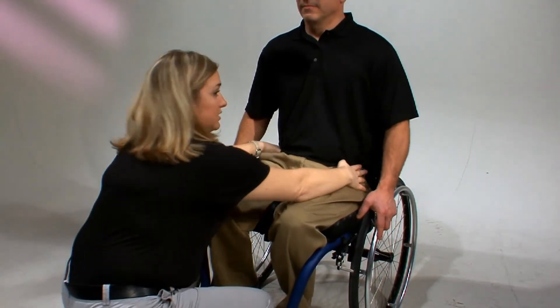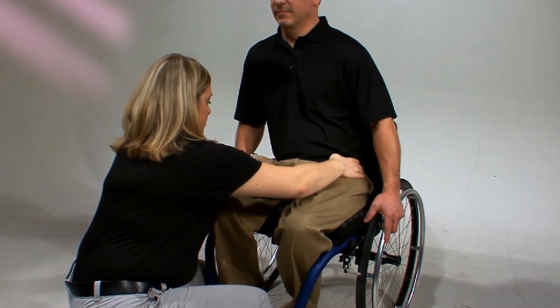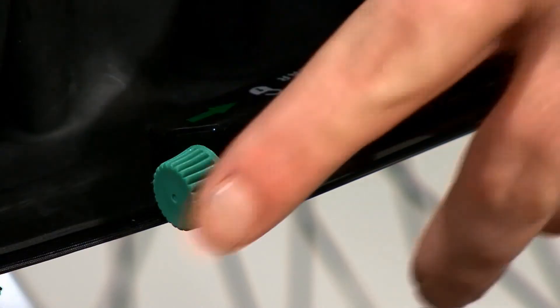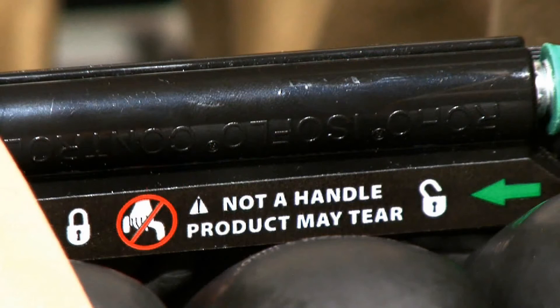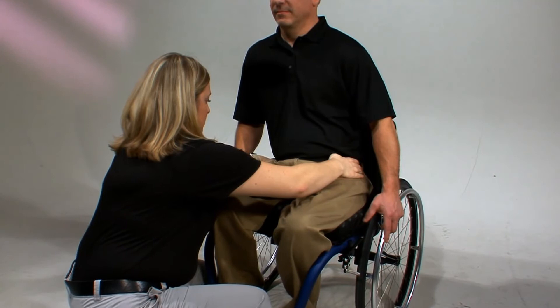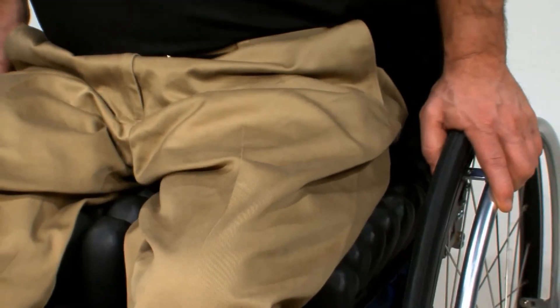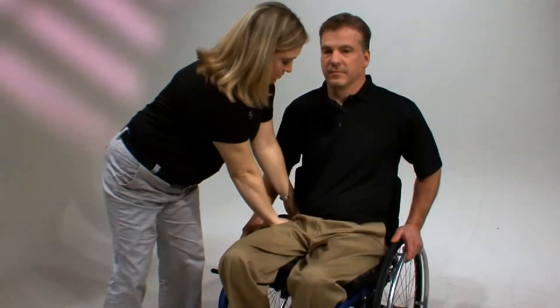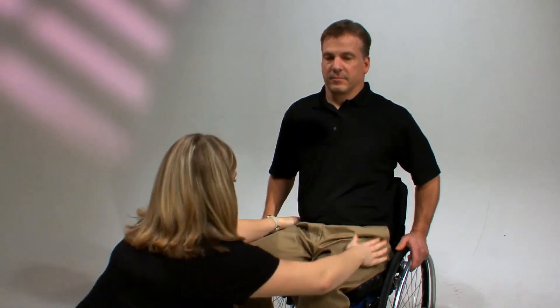Now let's talk about how to position someone with a flexible pelvic deformity while using the Isoflow memory control. With the cushion properly adjusted, make sure the Isoflow green knob is in the unlocked position. Next, manually correct the client's pelvis to the desired position. For example, if the client has a flexible left pelvic obliquity — meaning the left side of the pelvis is lower than the right — either have the patient lean towards the right or the caregiver can manually put downward pressure on the right hip until the desired position is achieved.